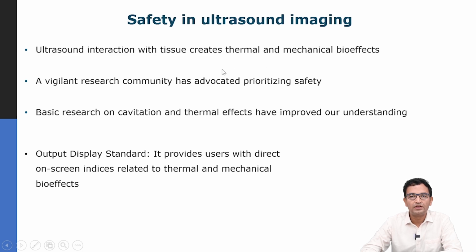Now, luckily, the safety profile of ultrasound has been excellent over the past 50 to 70 years, and that is because a vigilant research community has advocated prioritizing safety. A lot of basic research has been performed on cavitation and thermal effects, which has improved our understanding of these bioeffects. Now in this lecture, we will discuss the output display standard. This standard provides users with a direct on-screen index related to thermal and mechanical bioeffects and improves safety.